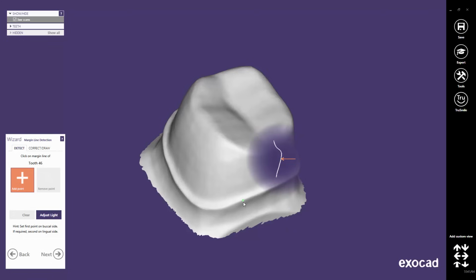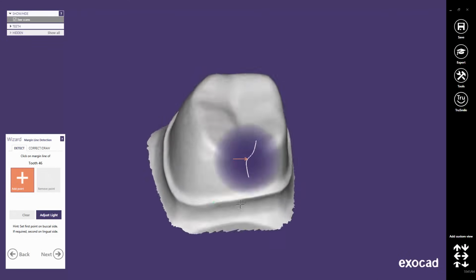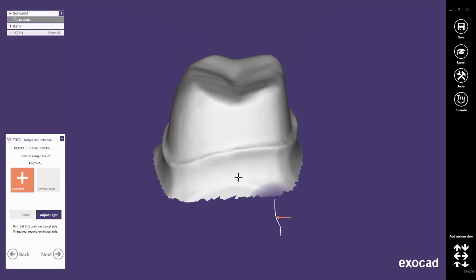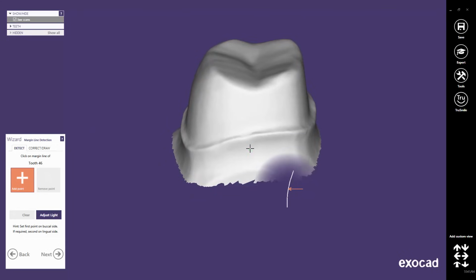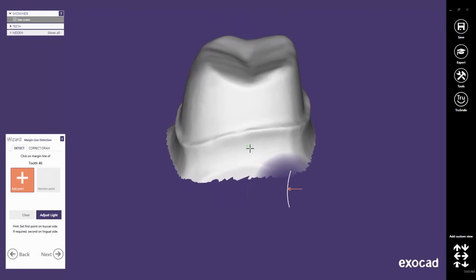You may navigate in 3D space using your mouse. Use the right mouse button, hold and drag, to rotate the view. Use the mouse wheel to zoom in and zoom out. Use both mouse buttons, hold both and drag, to pan the view. Alternatively, you can use the cursor keys to pan the view. Click the mouse wheel or middle mouse button to center the point you choose, and define this point as the new rotation center.